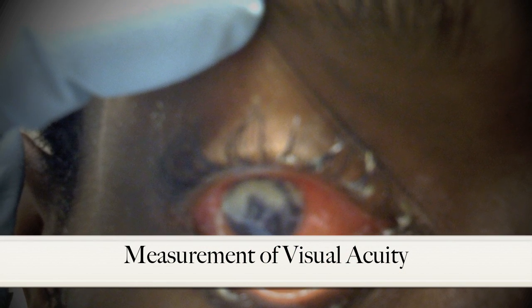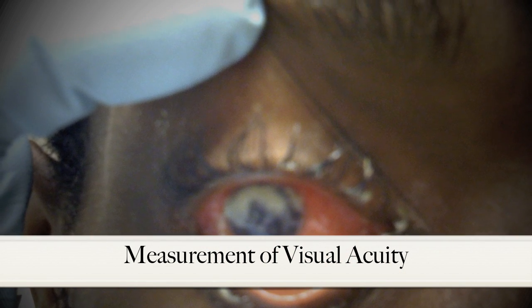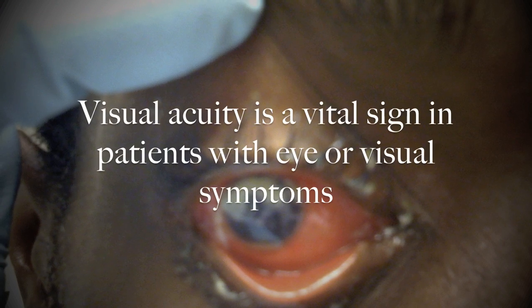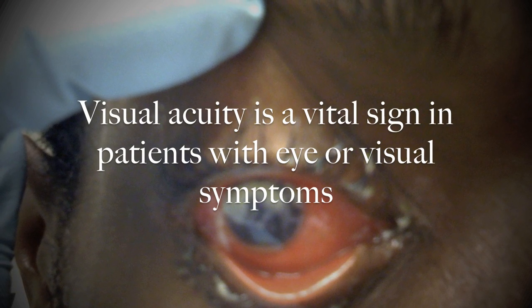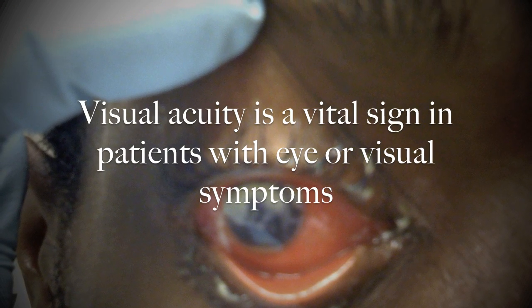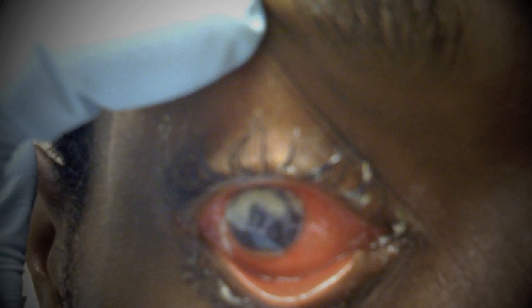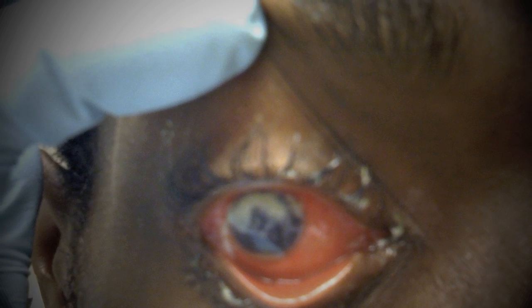In emergency settings, it is imperative to evaluate for potentially sight-threatening conditions. Visual acuity is considered the vital sign of the eye, and it's important to obtain for ED patients with eye or visual symptoms. However, visual acuity testing should never delay important interventions, like eye irrigation of a chemical burn.